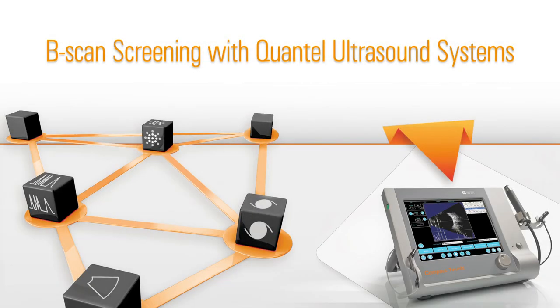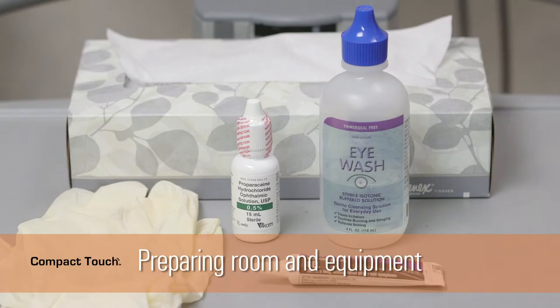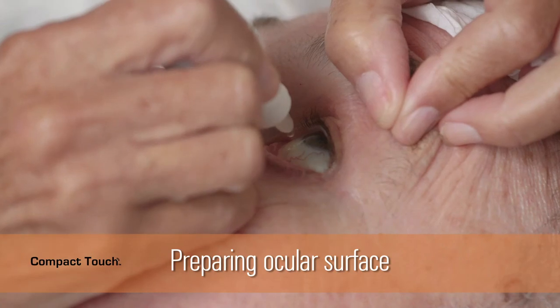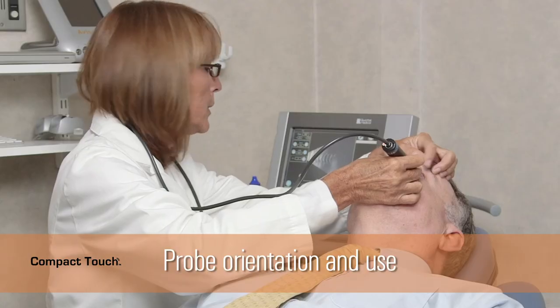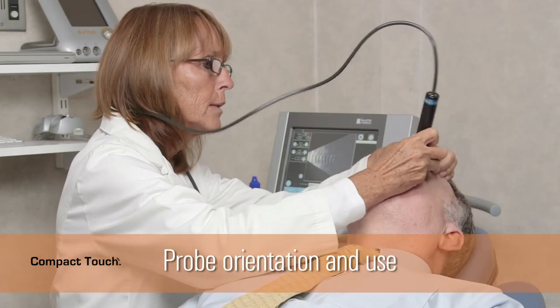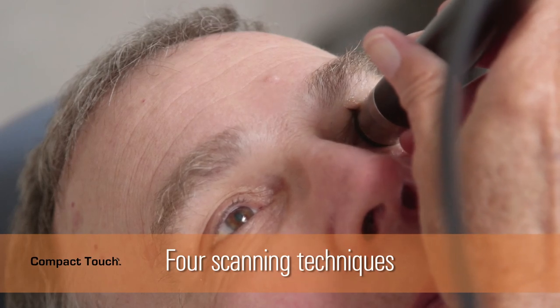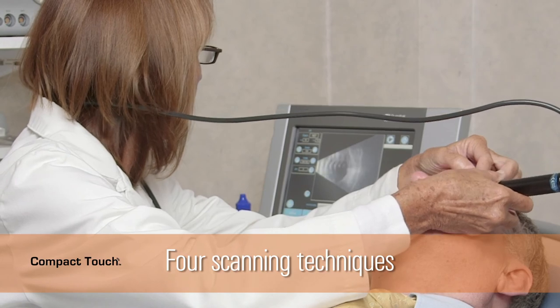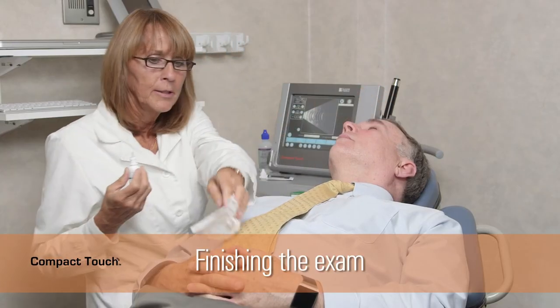To recap, in this presentation we discussed: preparing the room and equipment, counseling the patient, preparing the ocular surface, the orientation and use of the probe, four techniques for imaging different sections of the globe, the recommended sequence and selection of scans, and finally, how to wrap up the session.